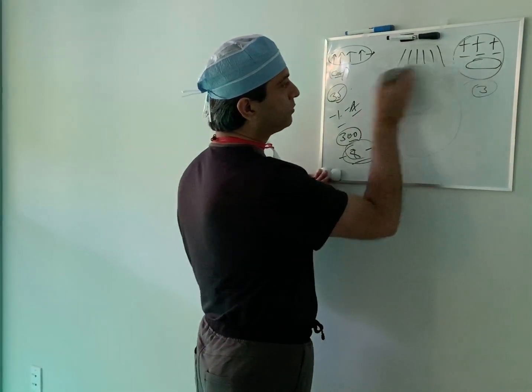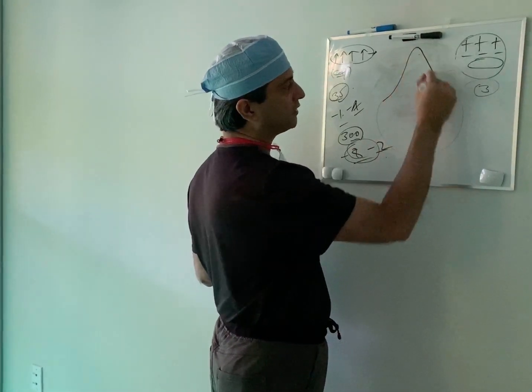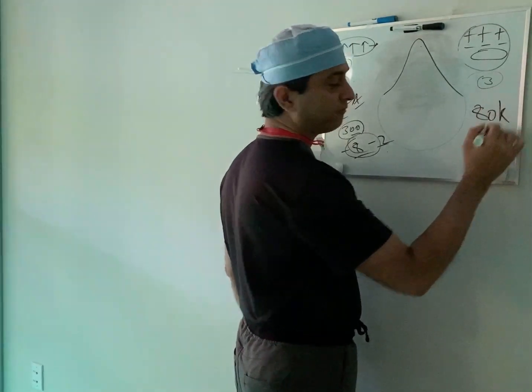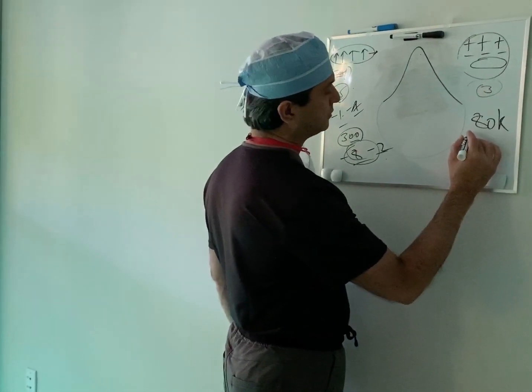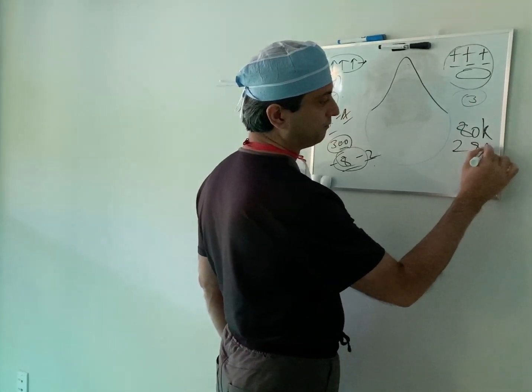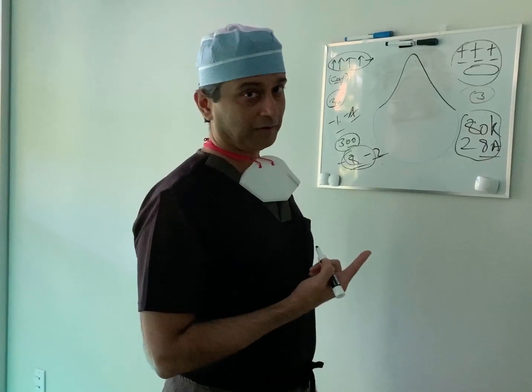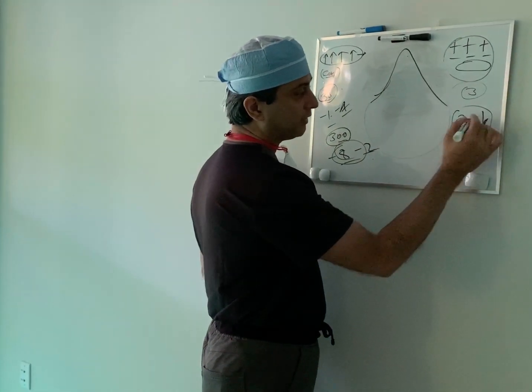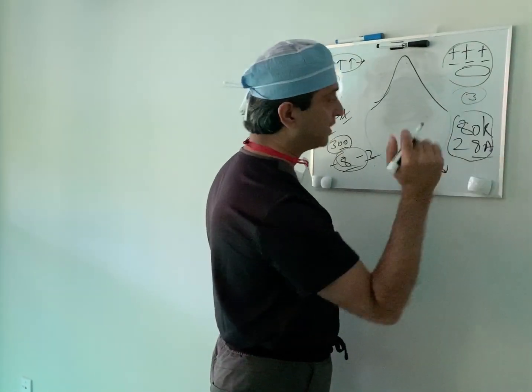Now let's take this into patients where you say, oh my God, I saw a deadly case, very difficult. There is no such thing as difficult. Let's give the cornea a value of 80 keratometry. In my webinar, I showed you all a cornea with 89 keratometry. Let's give it astigmatism, let's call it 28 astigmatism, all right? And now, obviously this patient will not be refractable. So you want to make sense out of it. I would put a ring, a single ring, get the astigmatism down, decrease the irregularity and increase the measurability.